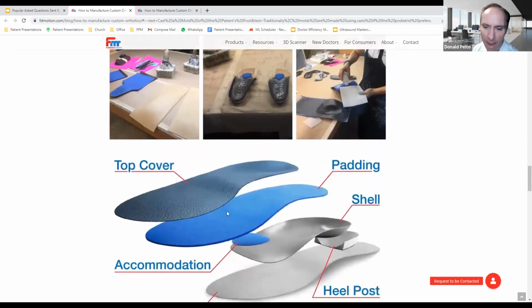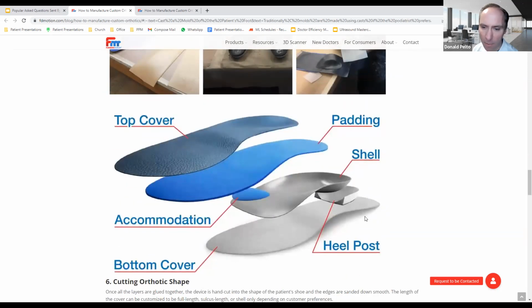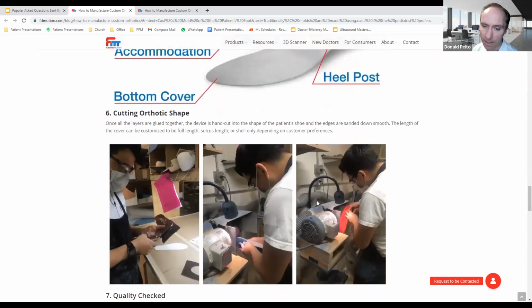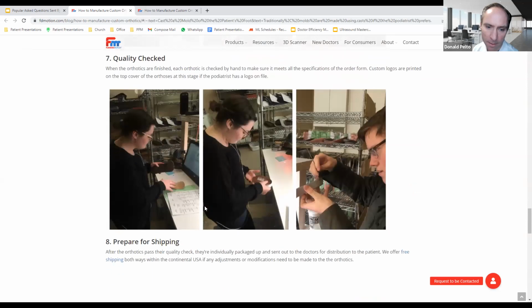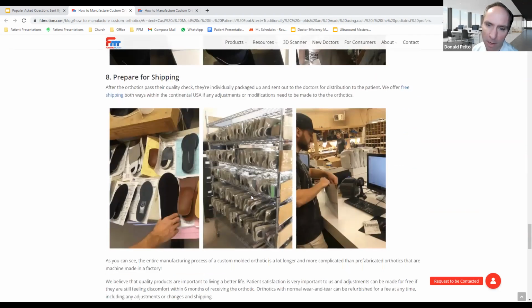So what you're going to have in an orthotic is the bottom cover, which might just be to protect it from squeaking. You're going to have a heel post, and that might be canted in a direction. You're going to have that shell that they make. Then you're going to have any paddings. Then there's some other type of padding, so it's not really rigid. And then you're going to have a top cover so it lasts longer. Then they cut it to shape. This is how they do the finishing of the orthotics, and then they check for quality. Then they ship them out to us.